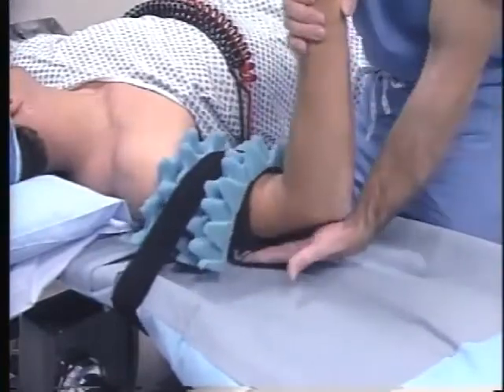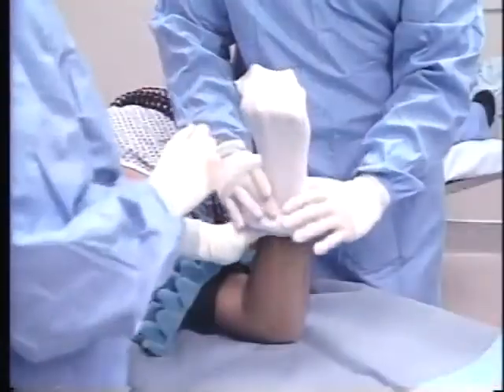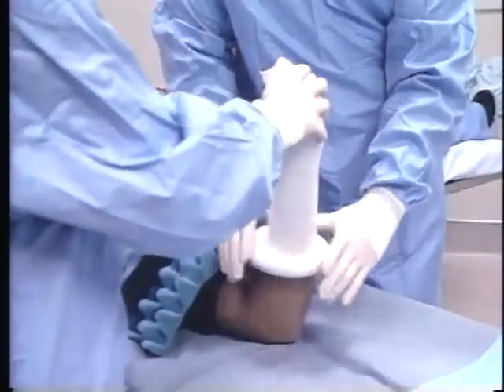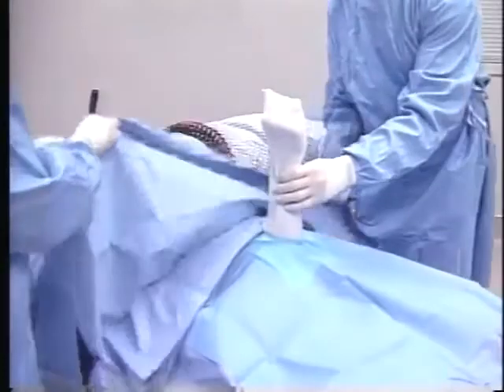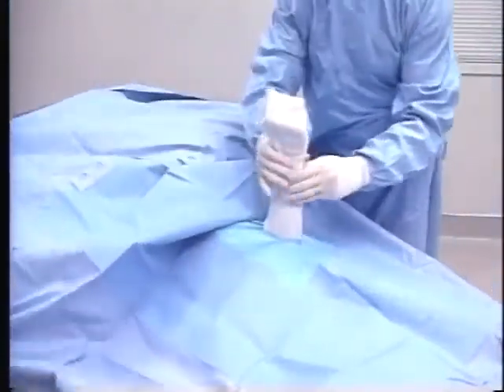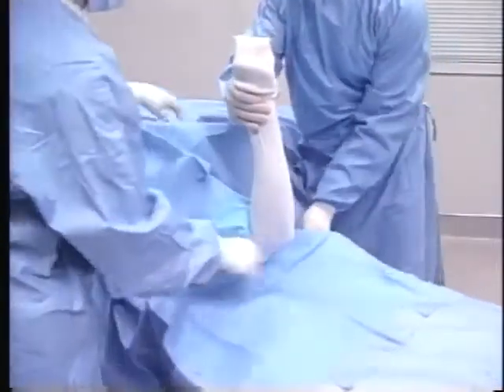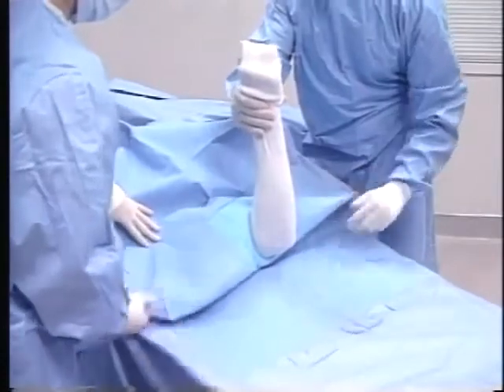The strap is not over-tightened and allows at least 90 degrees of elbow flexion. Next, after routine preparation, a stockinette is applied to the operative arm. The extremity drape is then passed over the arm. A fold is placed in the drape and is tucked under the elbow. The remainder of the drape is extended over the hand table, providing a flat, neat, sterile field.